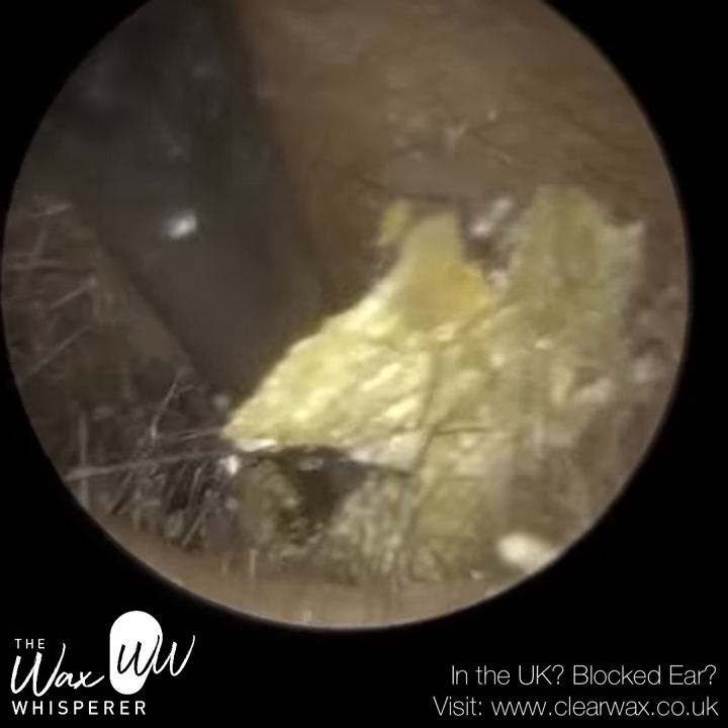There's quite another huge piece. This wax plug is lodged on the right-hand side — what we call the anterior recess. When the ear canal narrows and widens again near the eardrum, it creates a recess to the right-hand side which we call the anterior — the medical term for towards the front. Wax quite often, especially when people use cotton buds, gets impacted against the eardrum and into the anterior recess. All the telltale signs suggest something is being put in the ear, though it could legitimately be ear inserts, sleep plugs, or swim plugs. I did ask the patient, but they said they don't.